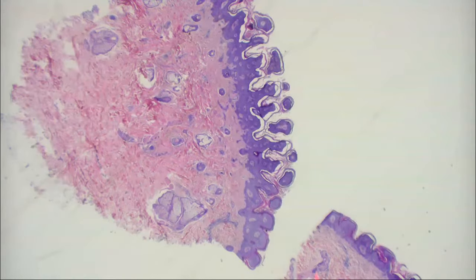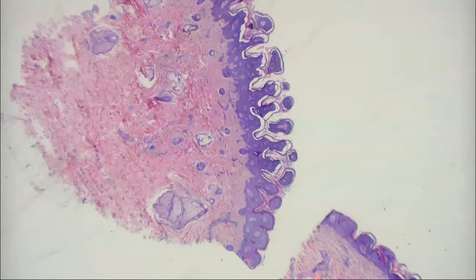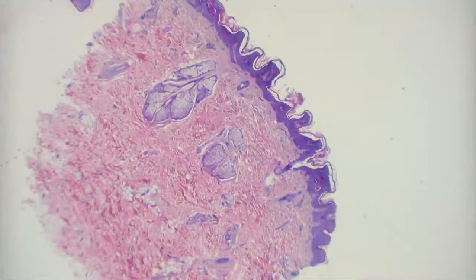Epidermal nevus. Yeah, this is an epidermal nevus. So epidermal nevi, there can be a lot of different histologic patterns of epidermal nevus. This is one pattern that kind of gives you this papillomatous epidermal mostly proliferation. Obviously, if there were a lot of sebaceous lobules up here, connecting to the epidermis, what would we call that? What's that type of epidermal or connective tissue nevus? When there's a lot of sebaceous lobules, this might actually be that in just an abortive form.